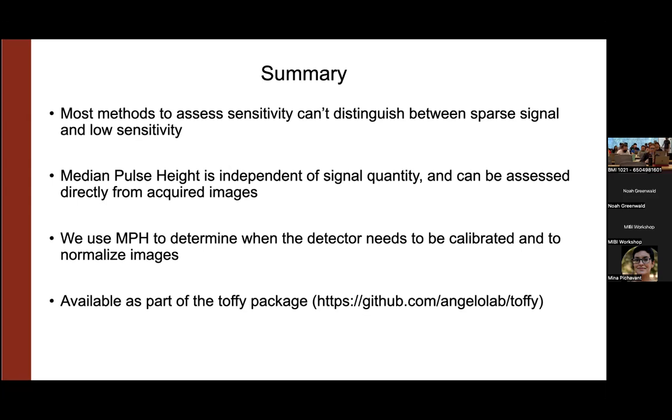Okay, so we had a question about basically how many FOVs does it take to get there? I think that's another big thing that changes over the lifetime of the detector. Initially, we're looking at maybe between 12 to 15 800 micron FOVs acquired at the coarse preset before we drop below this threshold. Once the detector is in middle age, we can often go 30 or 40 800 micron FOVs at coarse before needing to adjust if we're using our 50% cutoff.